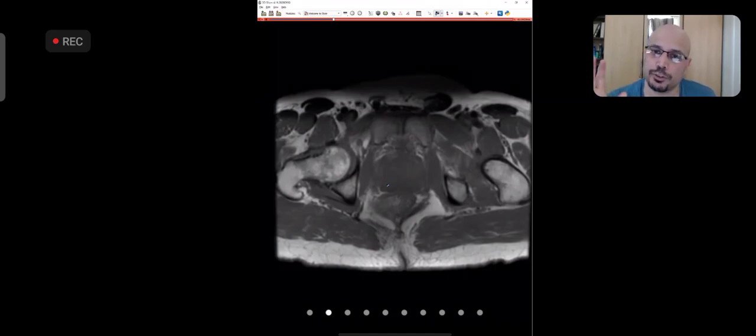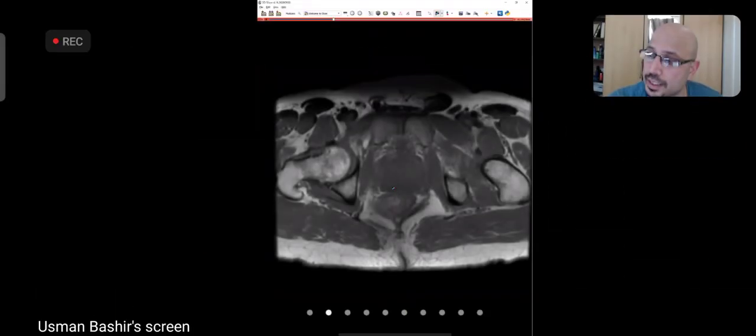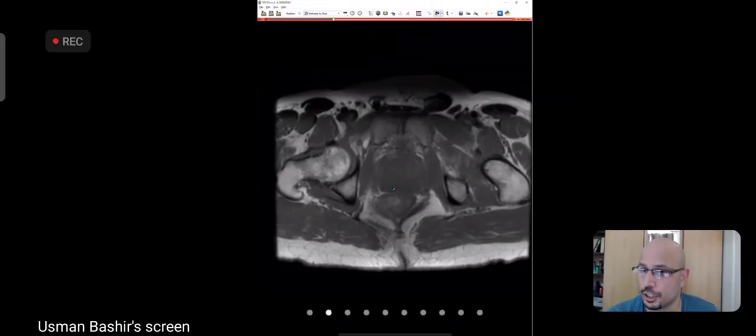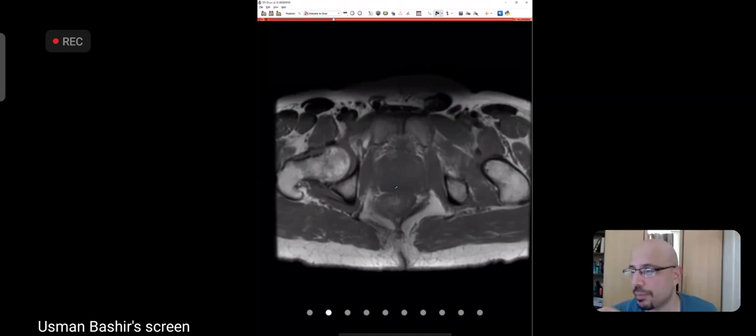If you've already done a biopsy on somebody, which you shouldn't do nowadays, but I remember in my Pakistan days, a lot of people would do a biopsy and then refer them for an MR, and that would give us a very confusing, blood-filled process.